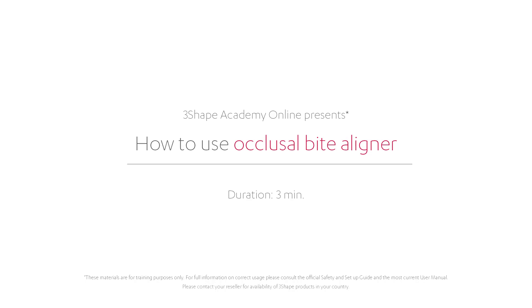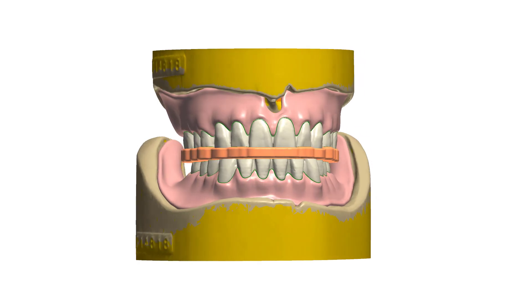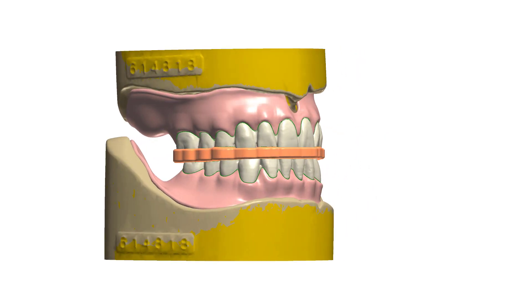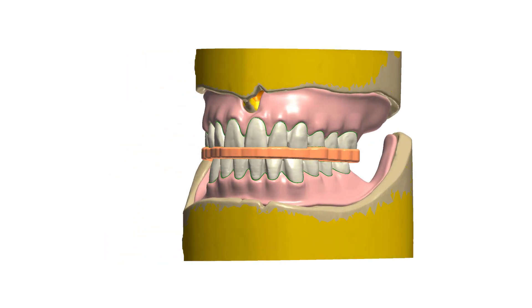In this video we will show you how to use an occlusal biter liner. The occlusal biter liner lets you preserve a patient's occlusion during the delivery of interim prosthesis. This will be an extra step while designing the full denture restorations.